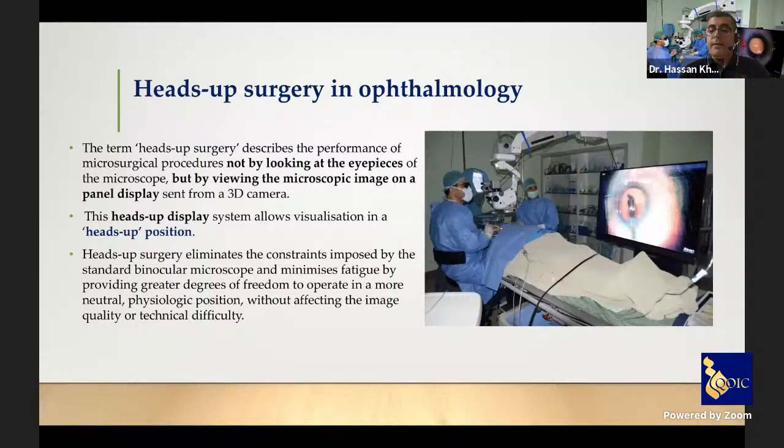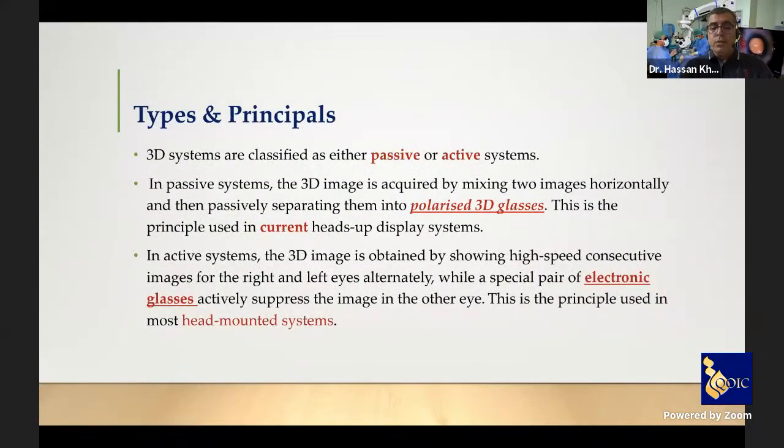In heads-up cataract surgery, the procedure is performed not by looking at the eyepieces of the microscope, but by viewing the microscopic image on a panel display sent from a 3D camera set in front of the surgeon. This heads-up display system allows visualization in the heads-up position, eliminating the constraints imposed by the standard binocular microscope and minimizing fatigue by providing a greater degree of freedom to operate in a more natural physiologic position without affecting image quality or technical difficulty.